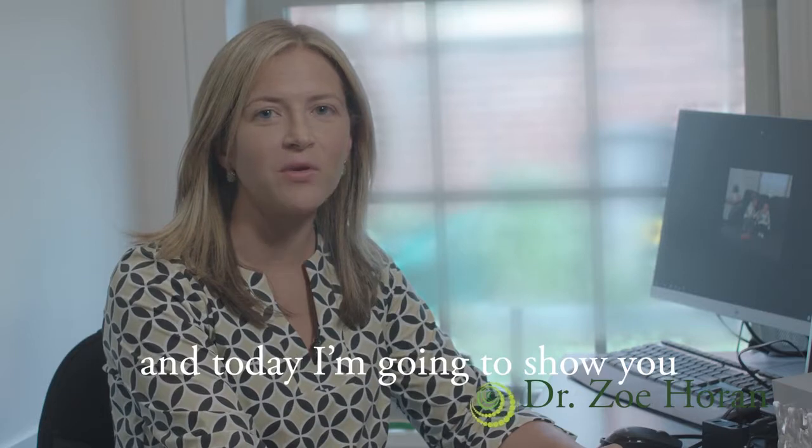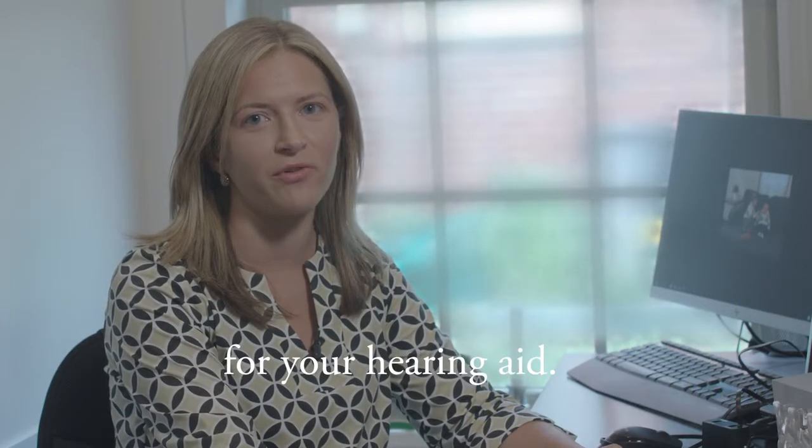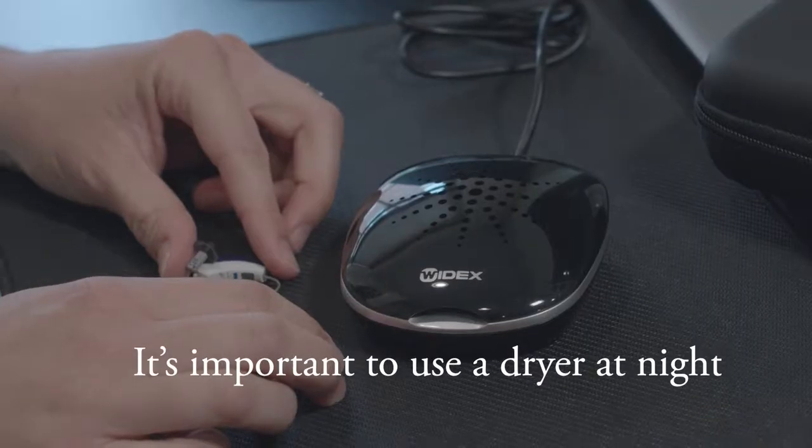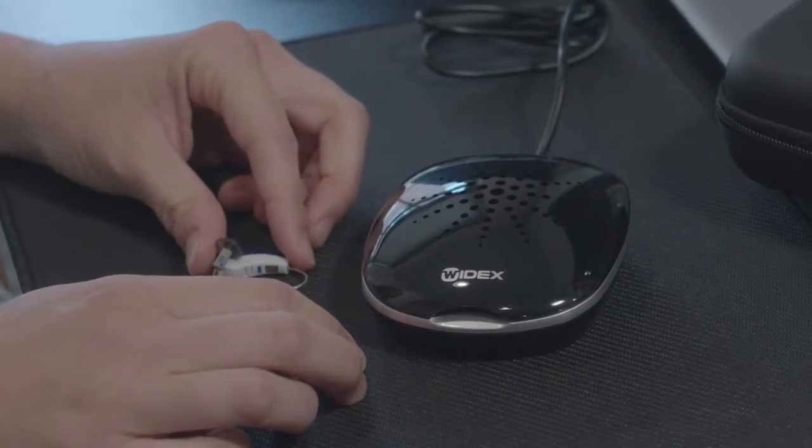Hi, I'm Dr. Zoe Horan with Resonance Audiology, and today I'm going to show you how to use the DryGo UV dryer for your hearing aid. It's important to use a dryer at night to dry out any humidity from your hearing aids.